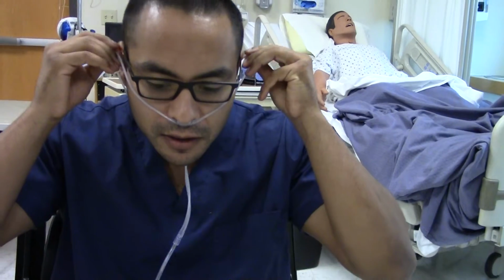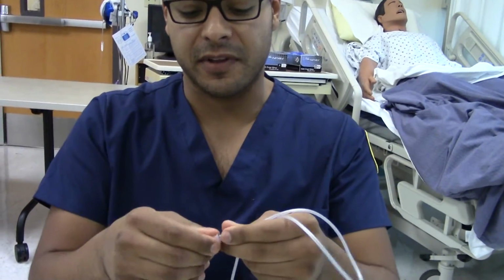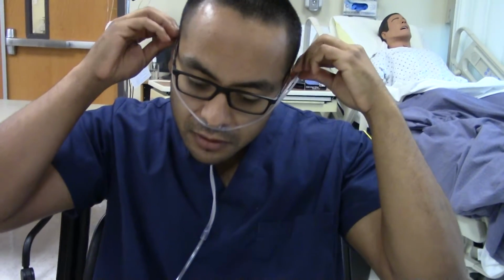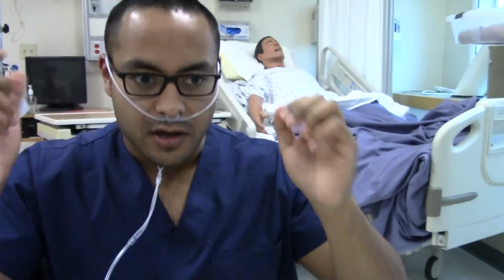Nasal cannula. It has a chain here. You can stretch it, make it longer, so you have more volume around the person's neck if it's a bigger patient. It's just tight, so I'll maybe flex it here. Okay, got it on. Cool.